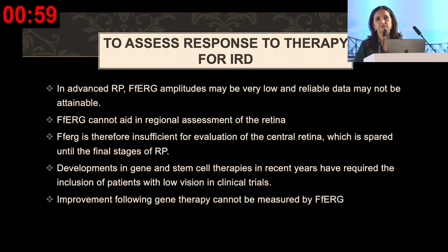Now, there's a lot of interest in gene therapy and stem cell therapy. In a case where full field ERG is already extinguished in most of these cases of LCA or RP, how are you going to know whether your gene therapy has worked? So here again, multifocal ERG is hugely useful. Most of the clinical trials use multifocal ERG to see whether the central responses are increasing in response to gene therapy.